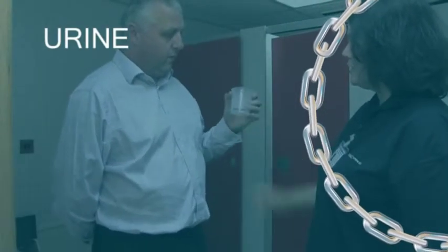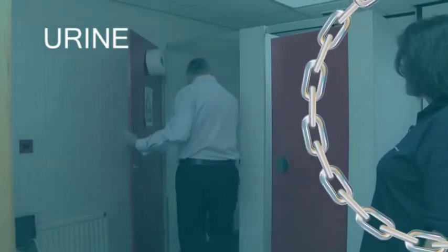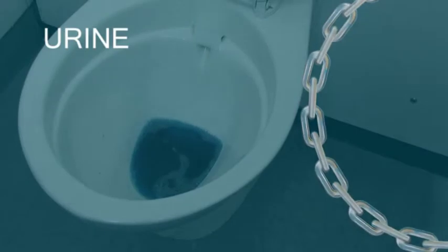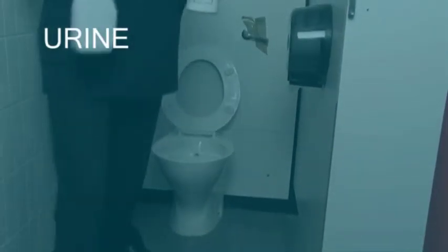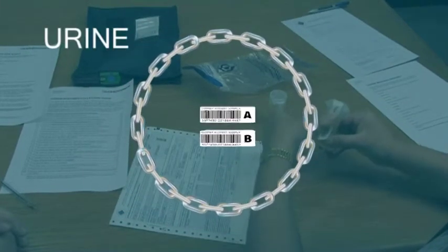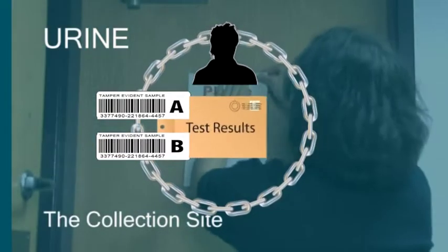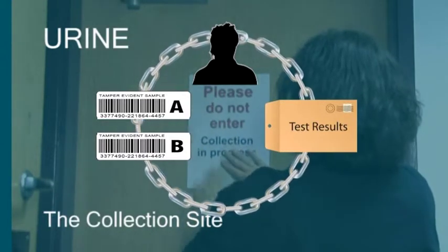Because you do not observe the donor giving the specimen, the collection procedures have to ensure that the donor has no opportunity to dilute, adulterate, substitute, or otherwise tamper with the specimen. If correctly followed, the procedures also prevent contamination and confusion between specimens, which are two issues of concern to donors. With these objectives in mind, we will look at the collection site before taking you through a collection.